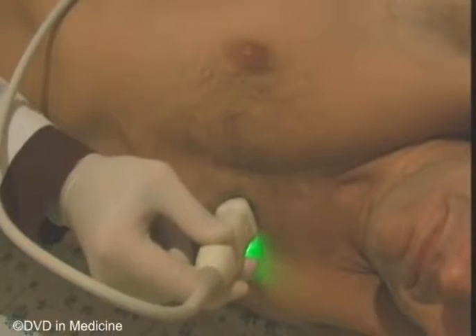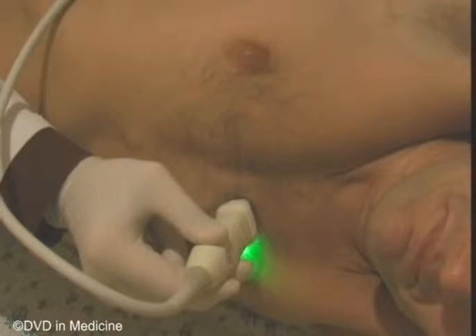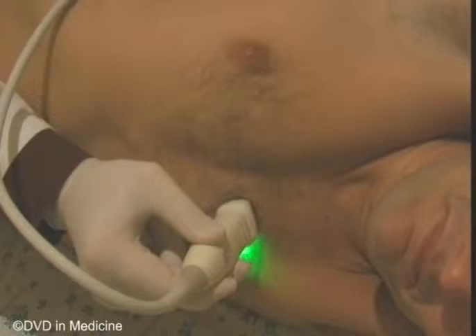If one sweeps the transducer a little more towards the base of the heart, one obtains a short axis view at the aortic valve level.